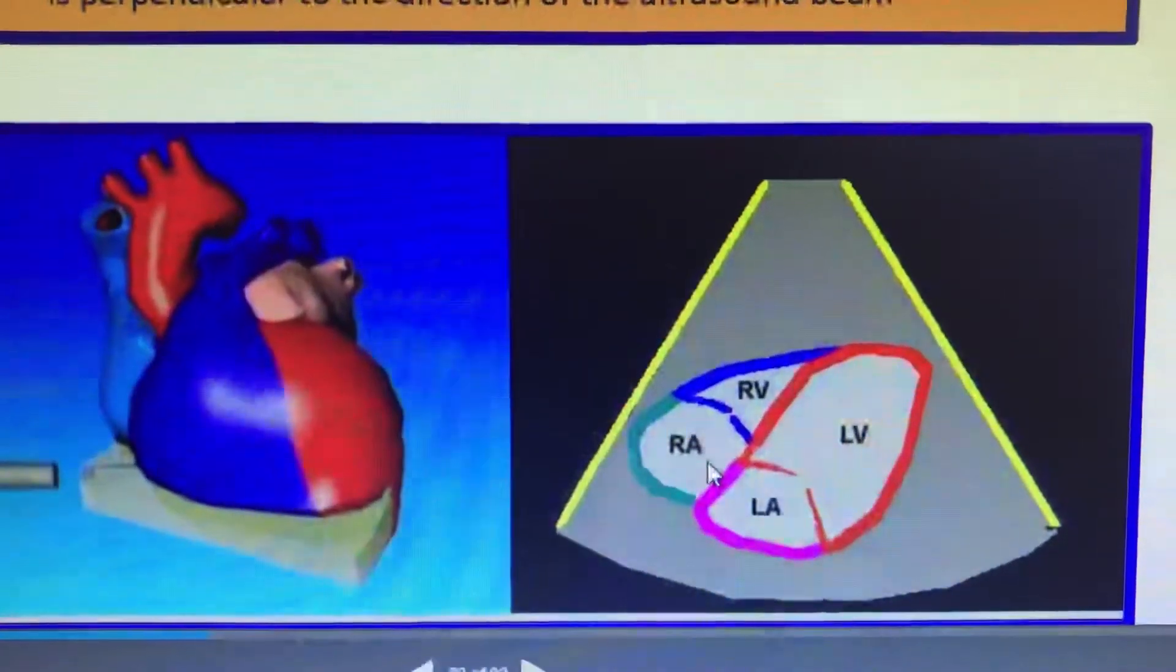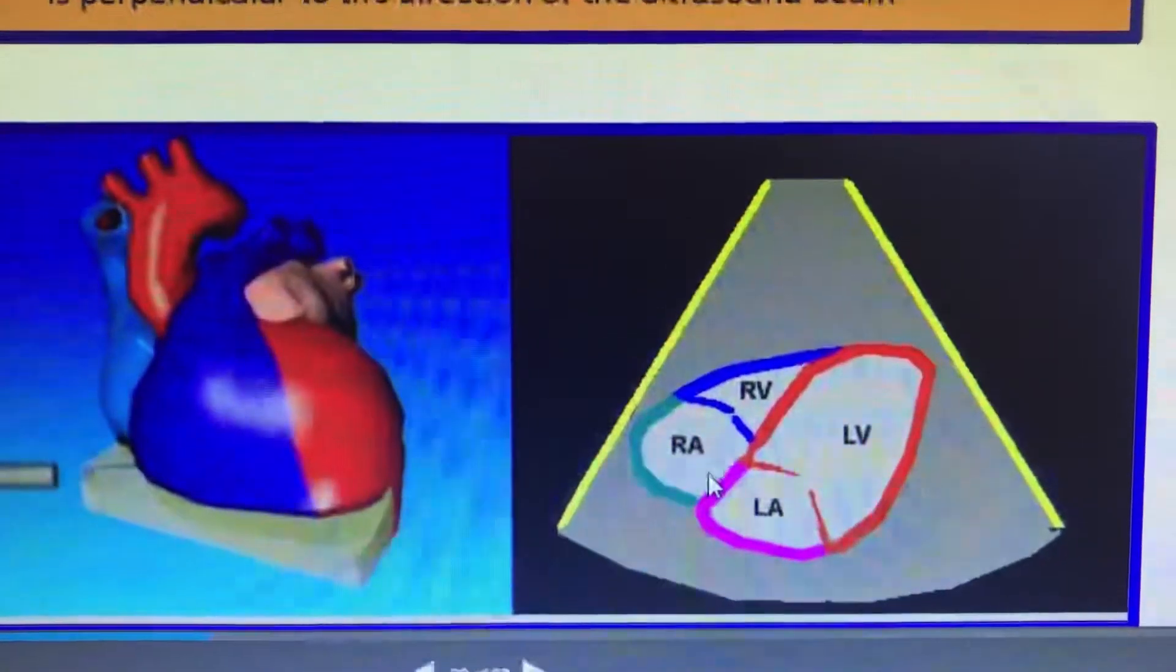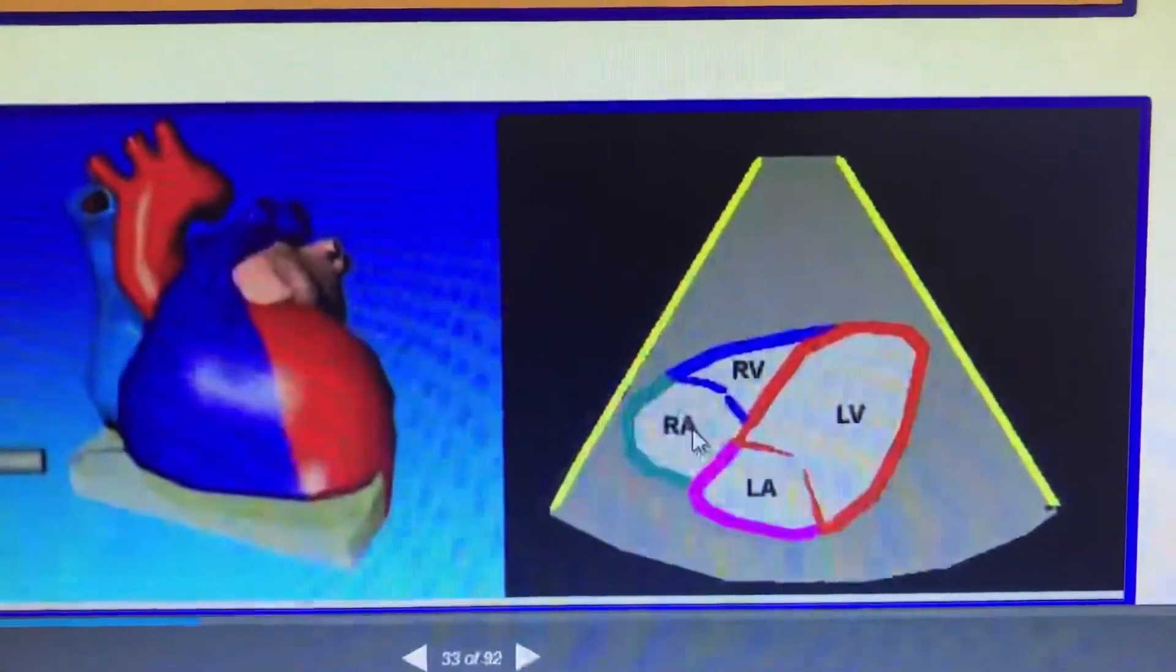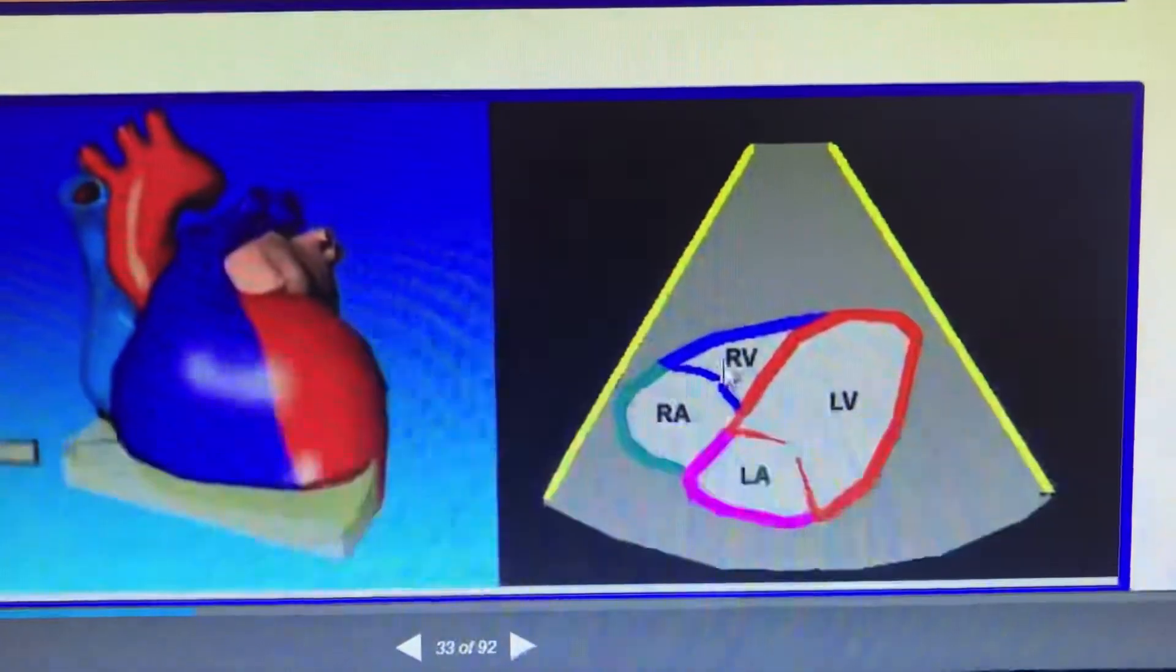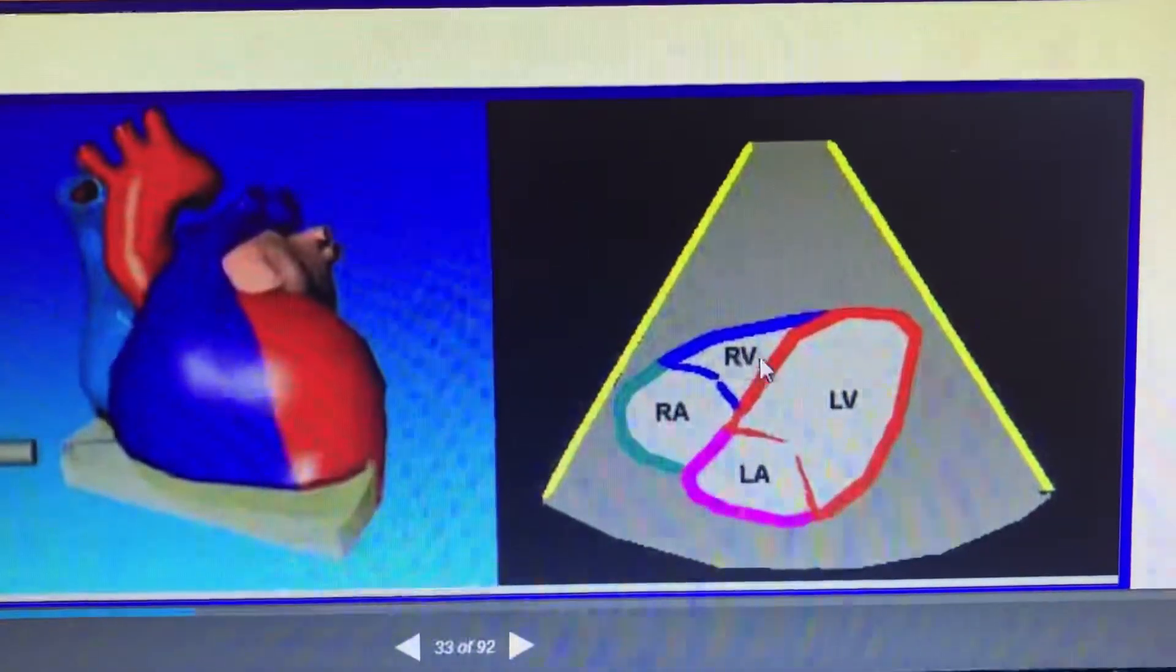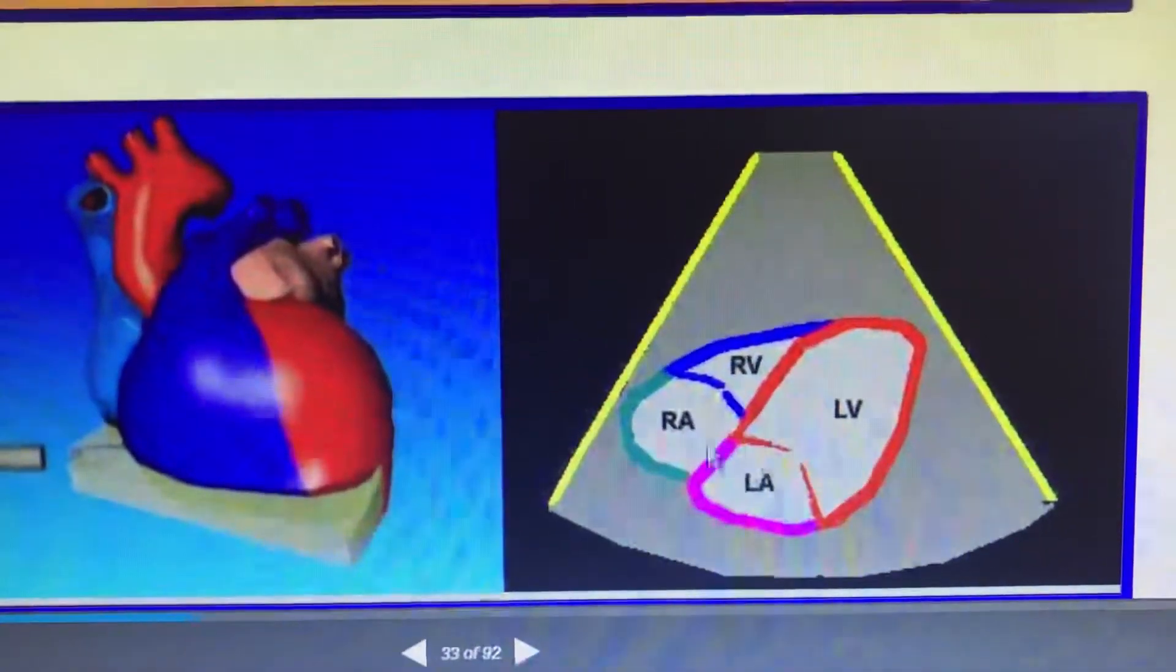If you increase the cranial or caudal angulation, you can see the IVC opening into the RA. Here you can see the RA, LA, RV, and LV. Most of the time, the RV is seen, and the IAS is very beautifully seen.